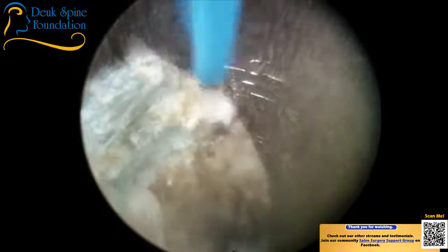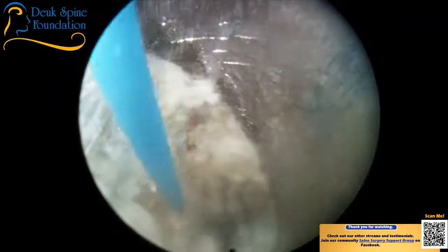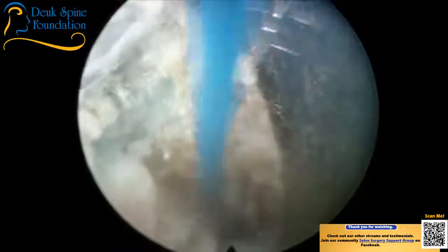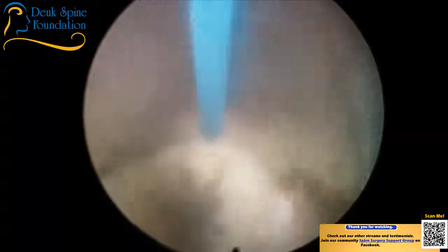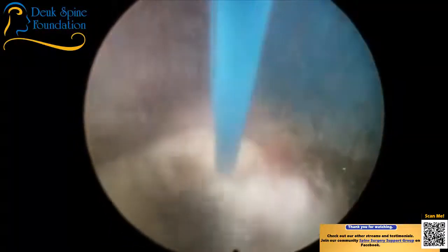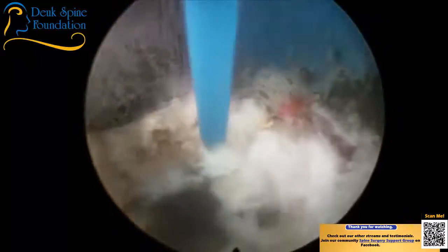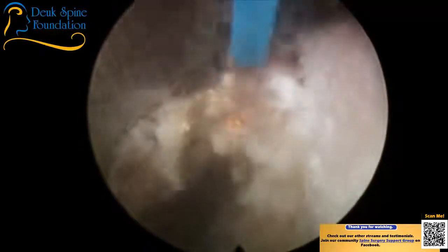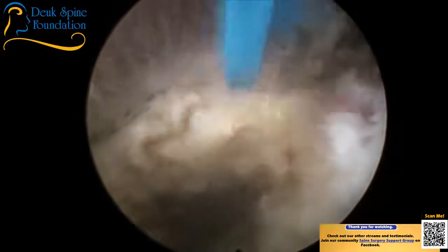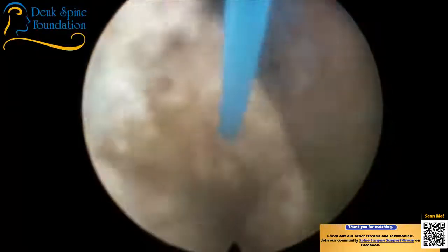Yeah, so she's starting to feel it a little bit. This is the bad part of your disc where all the pain's coming from, so it's not surprising that she's starting to feel it more. She's got nice anatomy, so maybe what I'll do is show you where the nerve root is. You're going to get to see it. I'll show it to you in 10 seconds, as soon as I'm done with the laser.